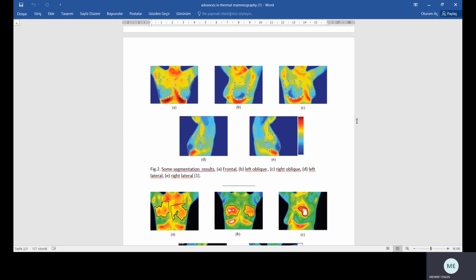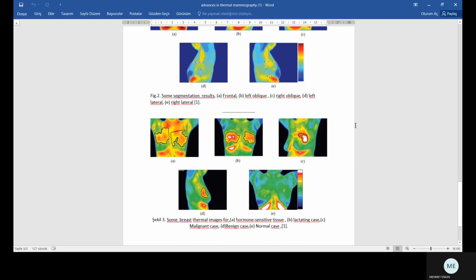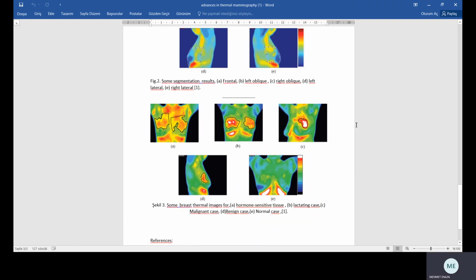In Niramai software, two varieties of abnormal regions are extracted. Niramai tools detect hot spots and warm spots in each view of the subject.